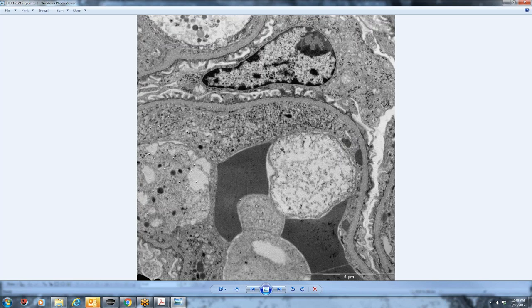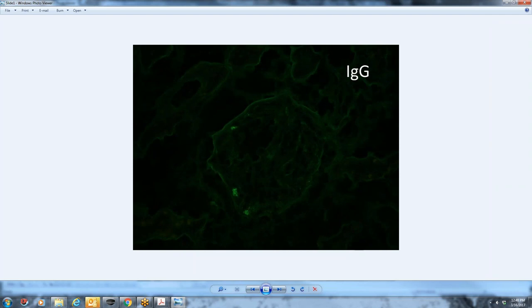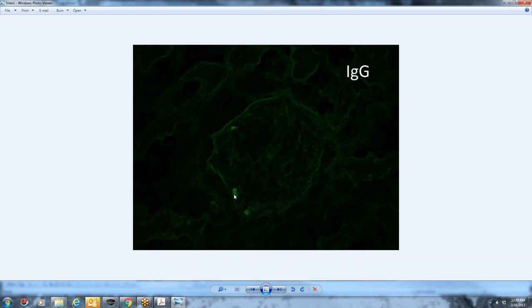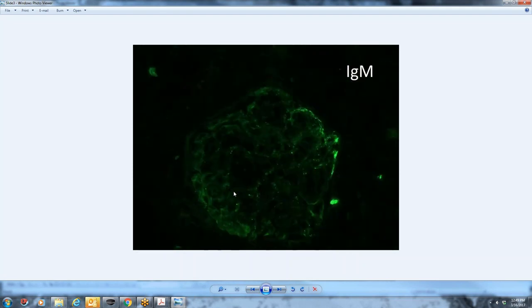And then this might be a true electron-dense deposit as well. But they aren't, this isn't a very electron-dense, it's not a heavy immune-complex-mediated disease where you're seeing immune complexes everywhere. The striking thing is just the degree of hypercellularity. Okay, so we're back to the same glomerulus. We were also wondering if there was immune-complex deposits. So as we didn't really see anything on EM, I'm not surprised that we're not seeing anything with IF.